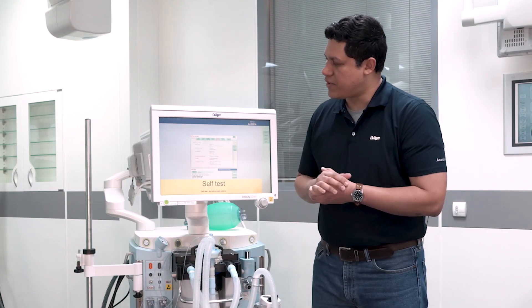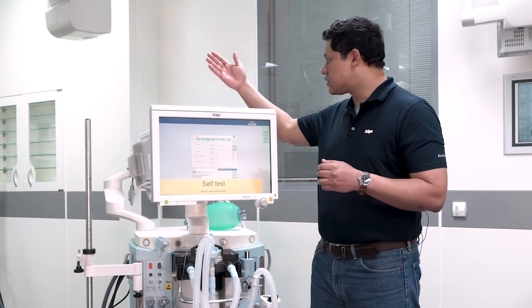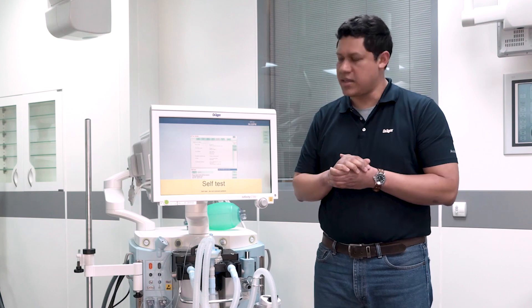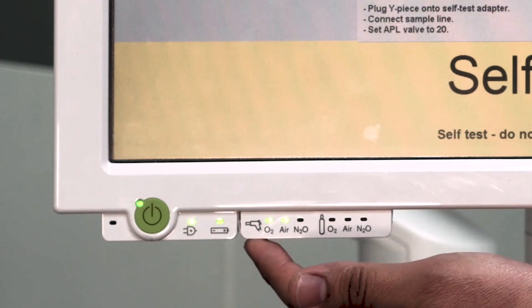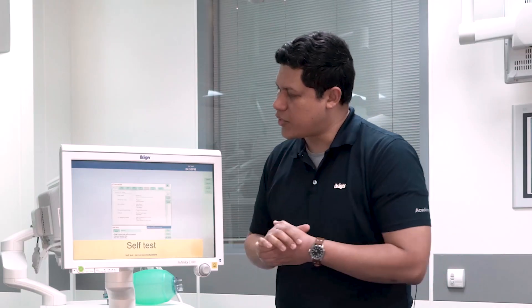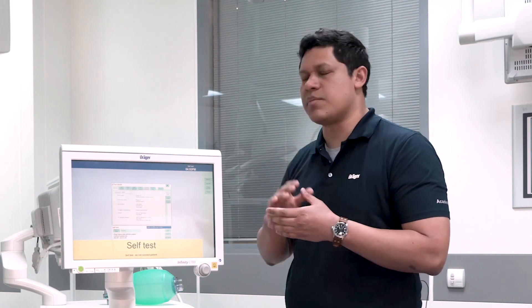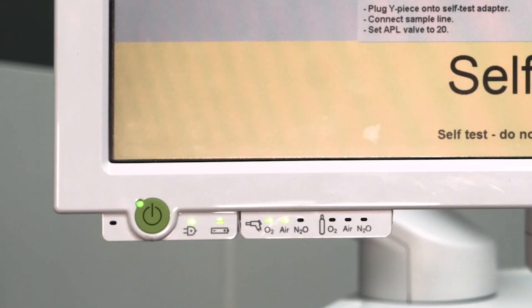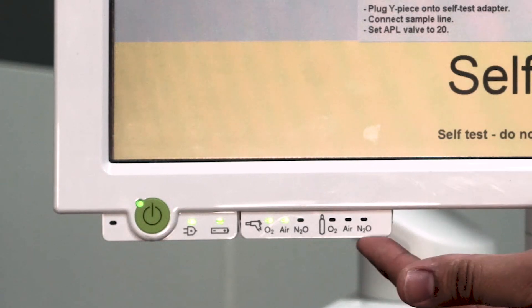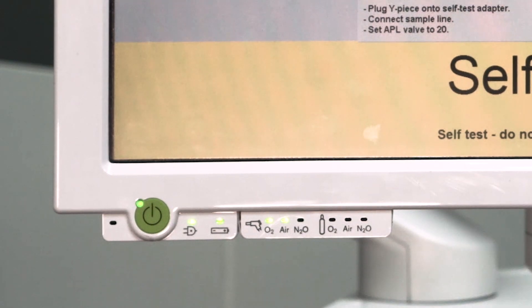The second component to verify is the central gas supply. We have to make sure that the hoses are connected to the central supply and we can also verify through the small LEDs that the gases are present. The third component are the gas cylinders. We have to go to the back of the anesthesia device and verify on the cylinders. In this case, we do not have backup cylinders and you can verify also that the LEDs are not lit.